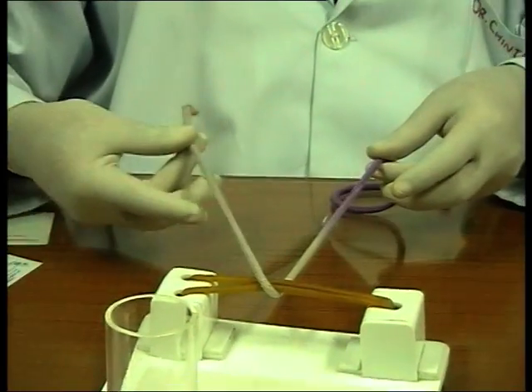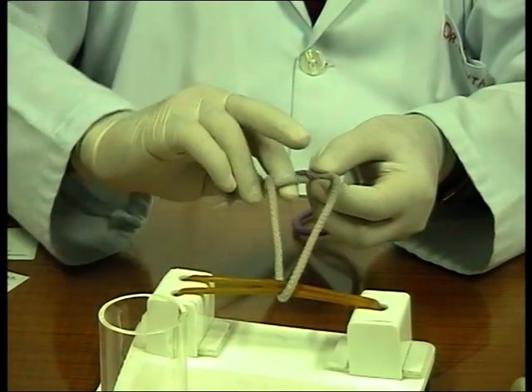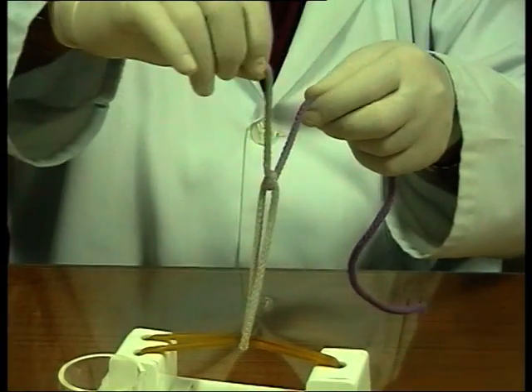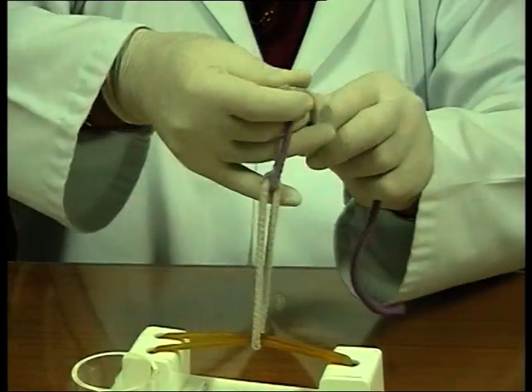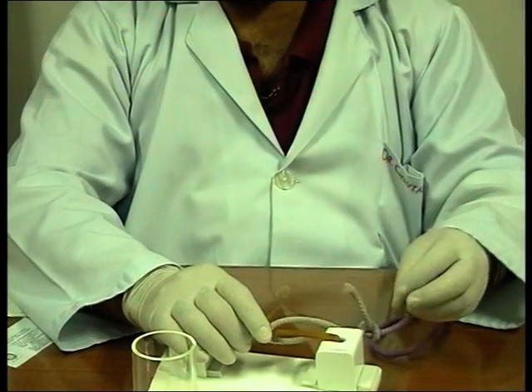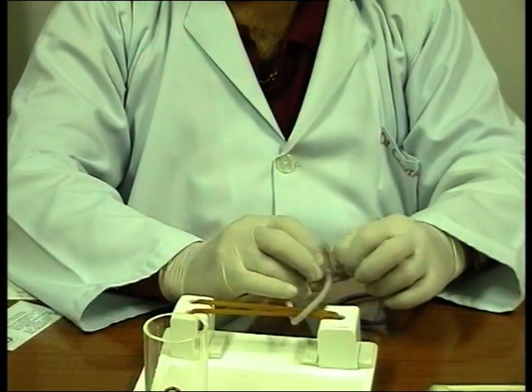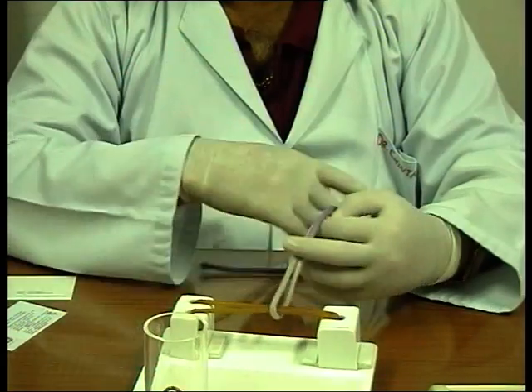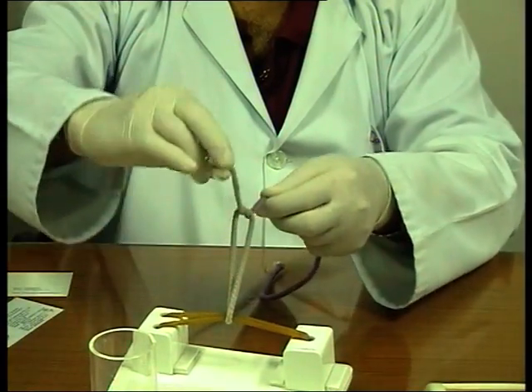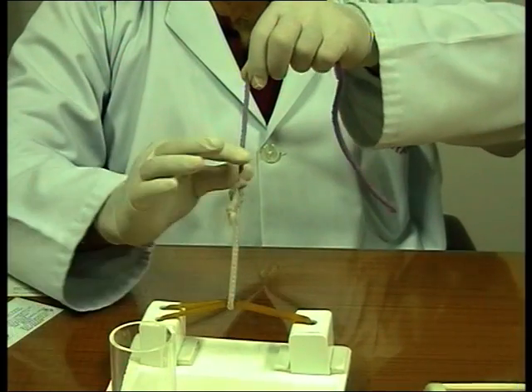Short end is away, long end is towards me. Figure of 4, hold, fish it out and don't cross. If you don't cross, and then put a middle. Index first, middle second. You can always argue that I've done everything all right, so why should the knot not be okay? The reason is you have actually not crossed. Clear? I hope that is clear. You want to put it? 1, 2, and if you keep the end long and straight.